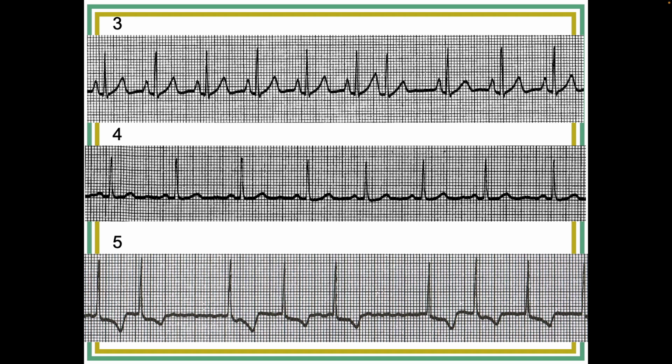Okay, let's do 2 more. So Cody, number 4, please. Switcher, please. Thank you. So we're going to start off with the rate, or regularity, sorry. Regular, at 80 roughly. It appears everyone has a normal P wave. Is it regular? Yes, regular. Normal P wave.